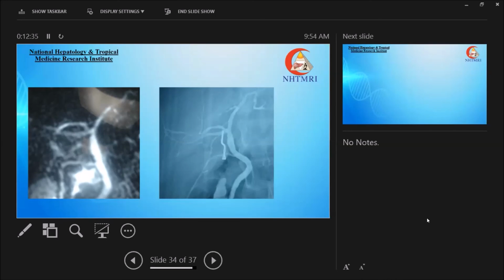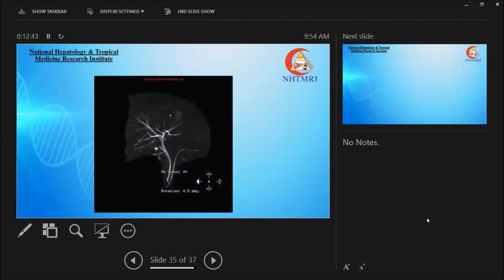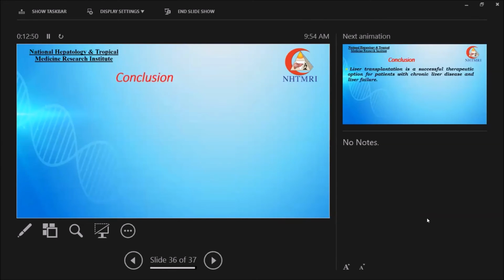but sometimes these kinds of ducts can turn into 2 ducts in the end in the OR, not just a single duct. So it's actually a single duct, but ending up as 2. And here we see the right posterior also draining into the left hepatic duct clearly. MRCP in donors is usually a challenging procedure.